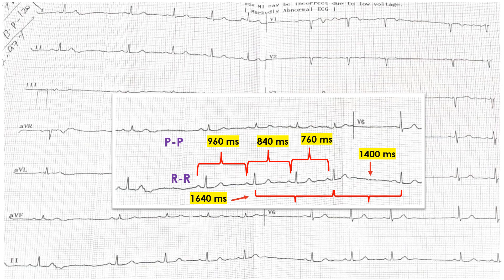This PP shortening is exactly what is happening in this ECG. Now looking at the RR intervals: taking two RR complexes where conduction is occurring, these measure 1640 milliseconds, and the pause is shorter at 1400 milliseconds. This is an important finding that I will discuss in further slides.